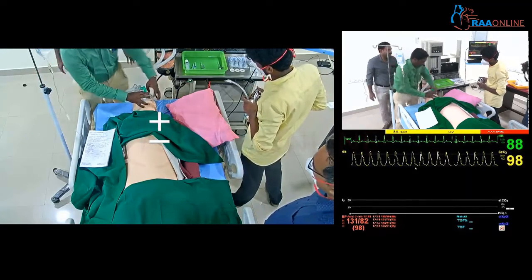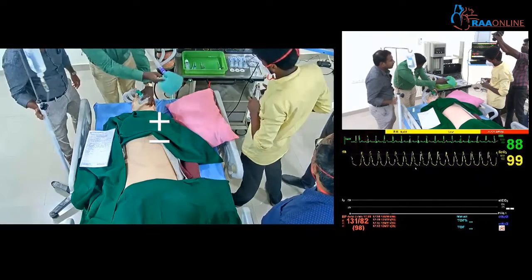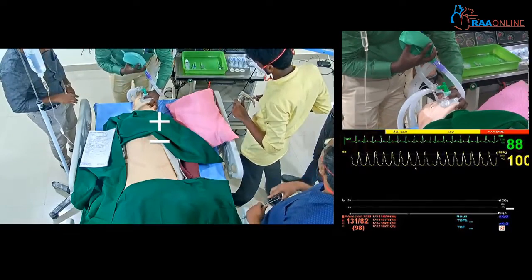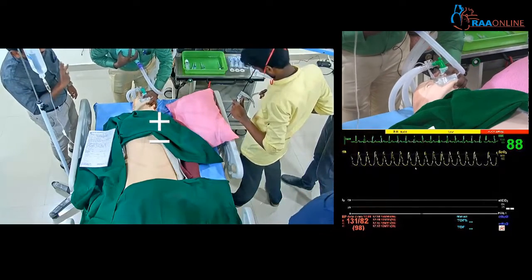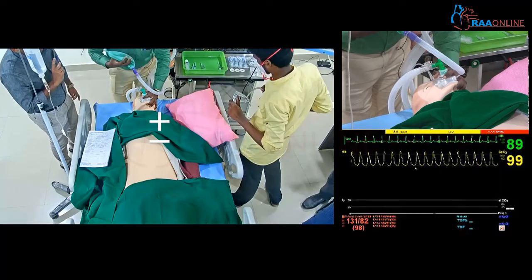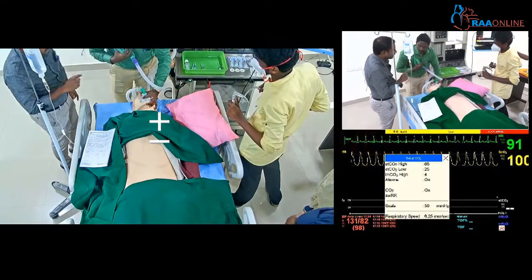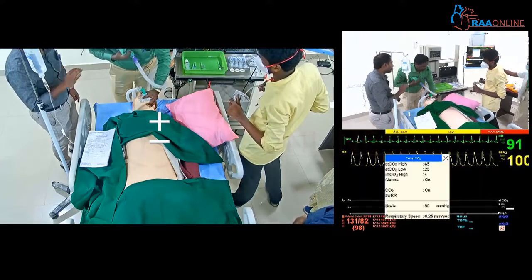Okay, sir. So we are not able to see the epiglottis. So it is CL grade 3B to CL grade 4. Now we are unable to intubate the patient. At present the saturation is maintaining, but ETCO2 is not coming. So what we will do is we will put a supraglottic airway device. At present we will try supraglottic airway.